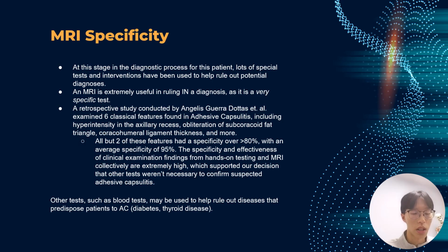And it's key to notice that there are other tests such as the blood test and other tests that may be helpful to determine the predisposed condition of the patient. But in terms of directly diagnosing an AC, MRI is still the best option for us.